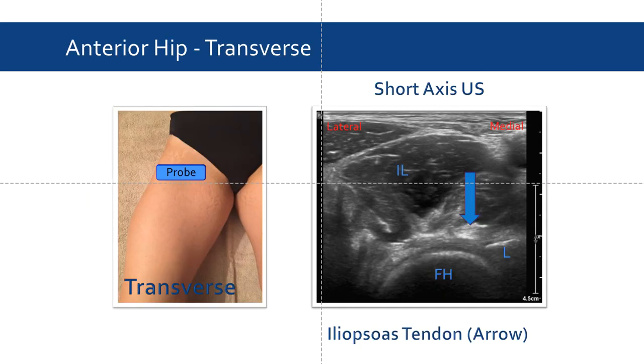Once the patient's leg is properly positioned, we can obtain a short axis view of the hip by placing the probe transversely at the proximal to mid thigh. In this view, we can identify the femoral head and the iliopsoas muscle. The blue arrow indicates the iliopsoas tendon. Notice how it is hyperechoic — this is how the tendon should appear.